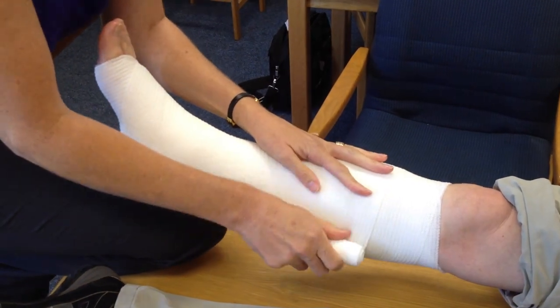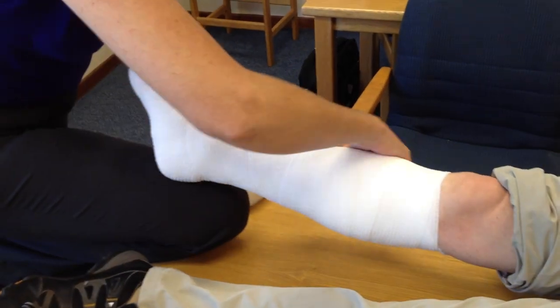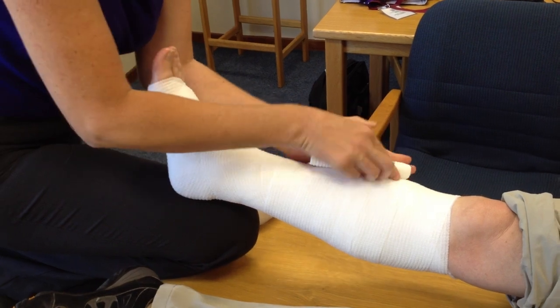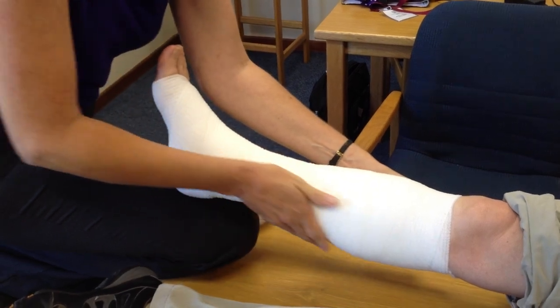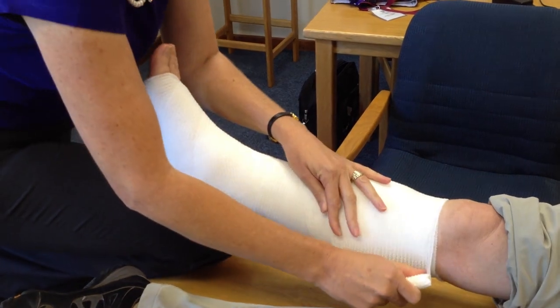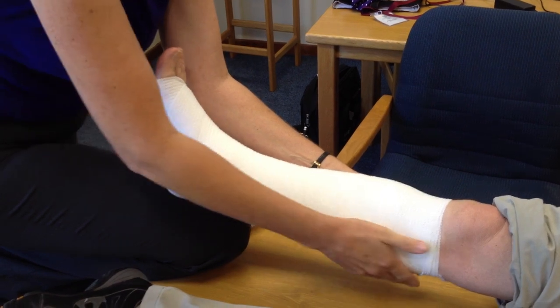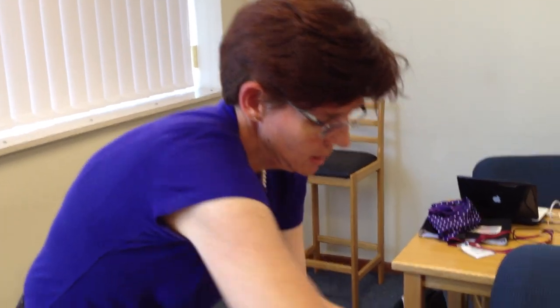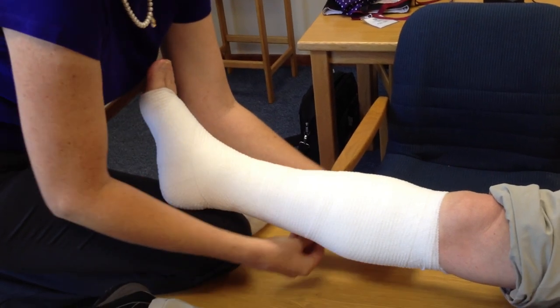You're checking behind the knee to make sure that it's not going to be restricted in that area. I have also seen that putting whatever extra layer you have on your bandage around the calf muscle supports the calf muscle pump to do its work when the patient is walking. So it is adding to the offloading of ankle volume if oedema is present.